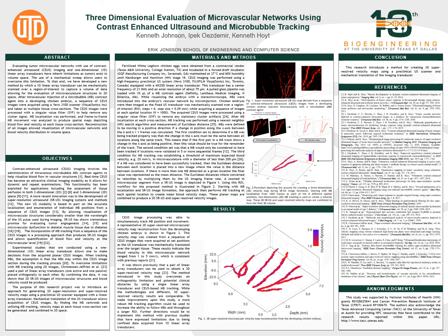To make improvements on this study, a more robust microbubble tracking algorithm could be used to increase the ability to follow microbubbles throughout a larger region of interest. Further directions would be to implement this method with previous studies that have expressed limitations due to being confined by data acquired from 1D linear array transducers.